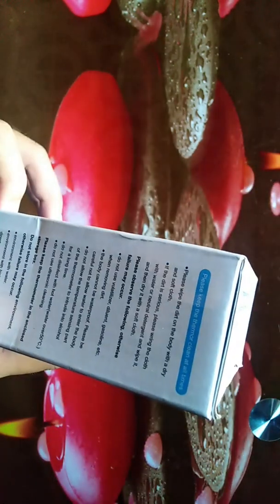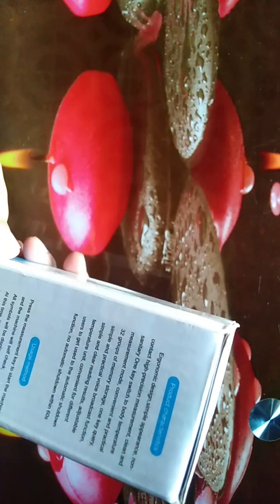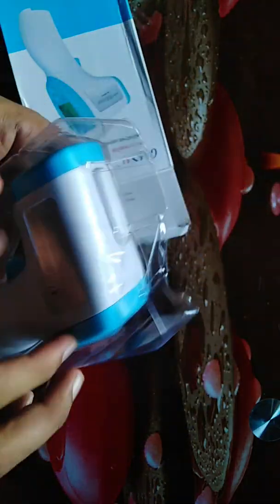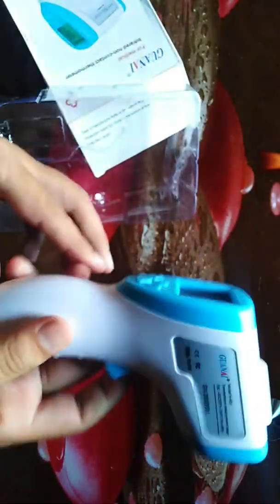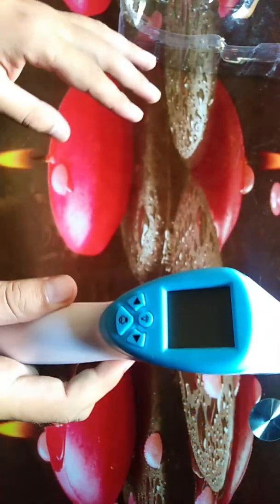Now let's look at the usage conditions you need to know about. I will show you these in detail. This is the non-contact infrared thermometer as you can see here.